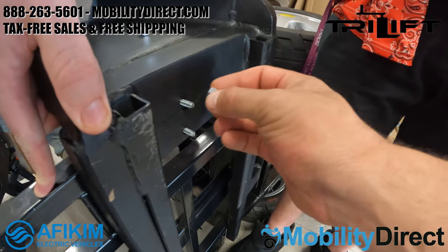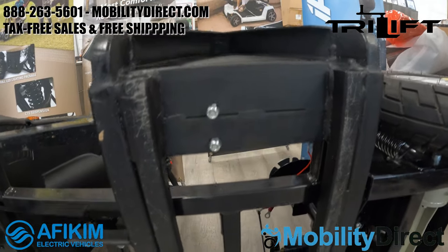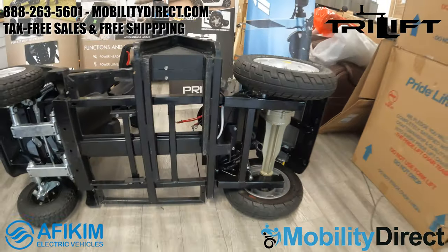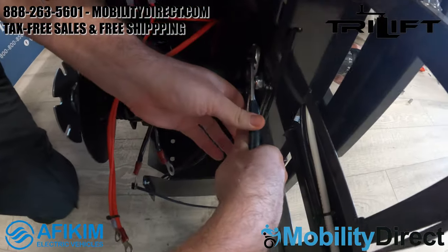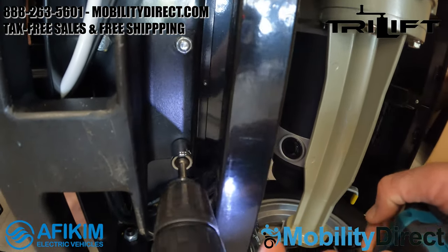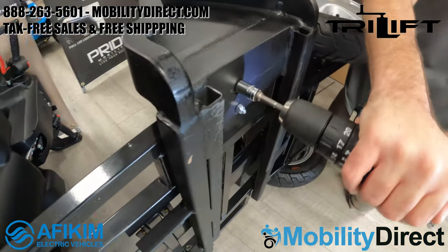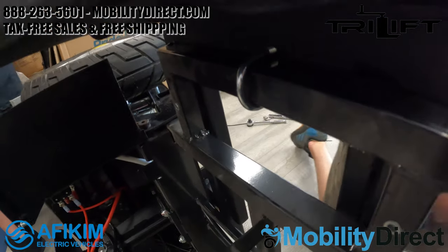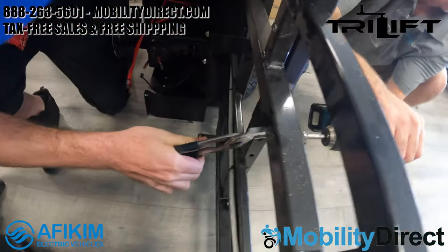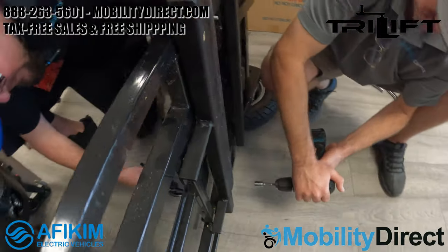We've been doing everything finger tight and now we're going to start tightening everything up with our tools. We're going to fast forward some of these parts — all we're doing is tightening everything up so it's nice and secure. You want to make sure that everything is tight so nothing is shaky or wobbly when you go to lift and lower your Afikim S4. This scooter weighs over 300 pounds with the batteries, so everything must be installed correctly and tightened down very well.